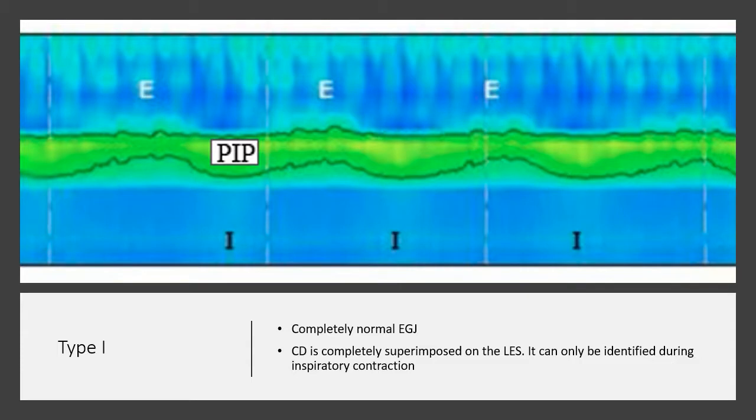A type 1 gastroesophageal junction is completely normal. The crural diaphragm is completely superimposed on the lower esophageal sphincter. It can only be identified during inspiratory contractions.